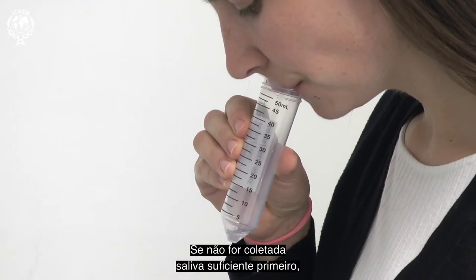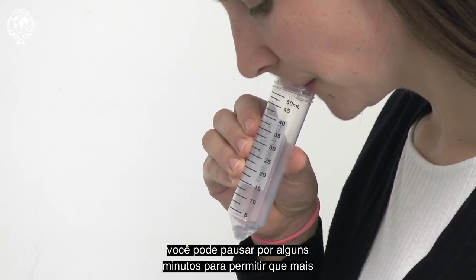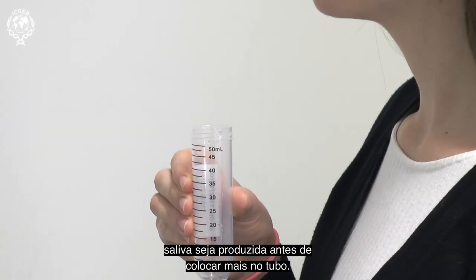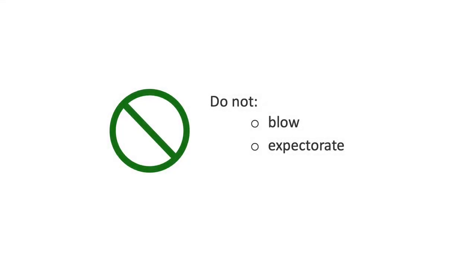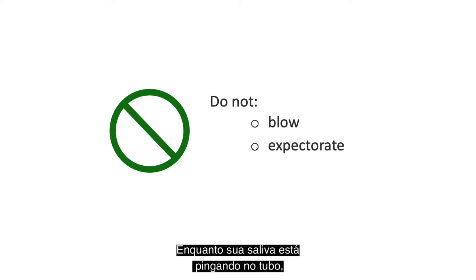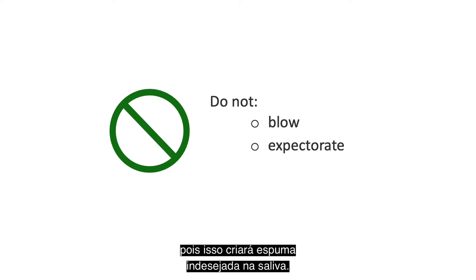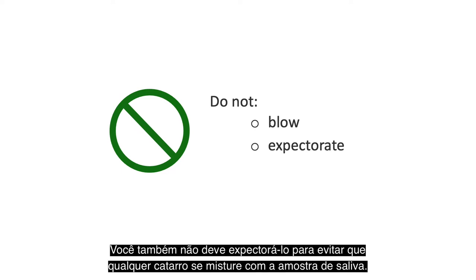If not enough saliva is first collected, then you can pause for a few minutes to allow more saliva to be produced before drooling again into the tube. While your saliva is drooling into the tube, you should avoid any blowing or spitting to quicken the process, as this will create unwanted foaming of the saliva. You should also not expectorate, in order to avoid any phlegm mixing with the saliva sample.